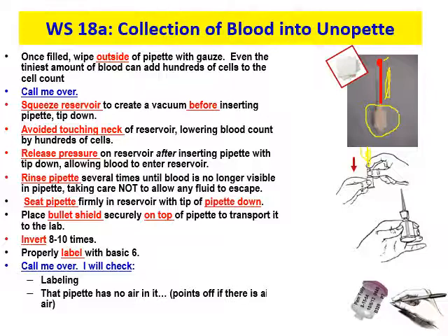Rinse the pipette several times until the blood is no longer visible, taking care not to allow any fluid to escape — be very gentle so you don't shoot the diluent out the top. Seat the pipette firmly into the reservoir with the tip down, and place the bullet shield securely on top to transport it to the lab. Invert it eight to ten times once all the blood is down in the diluent. Then properly label it with the basic six, or peel the label from your requisition and apply it. Remember: no air in that capillary tube.